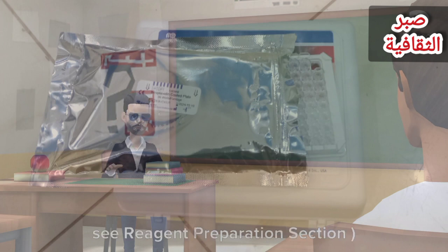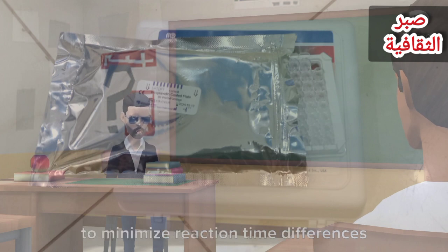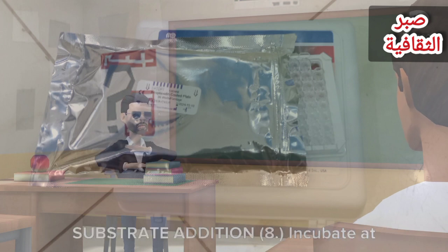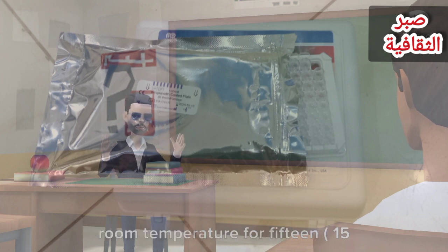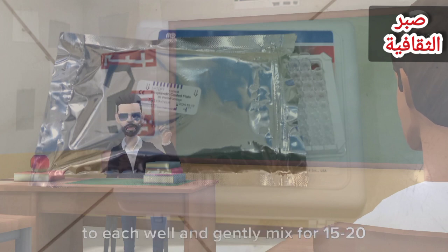additional times. 7. Add 0.100 milliliters, 100 microliters of working substrate solution to all wells. See reagent preparation section. Always add reagents in the same order to minimize reaction time differences between wells. Do not shake plate after substrate addition. 8. Incubate at room temperature for 15 minutes. 9.